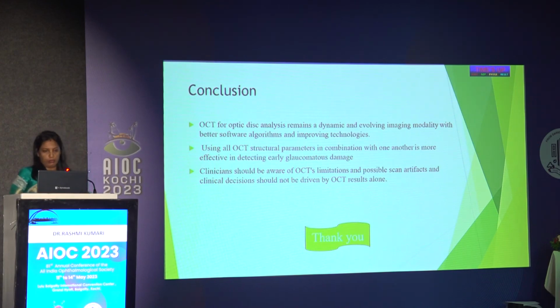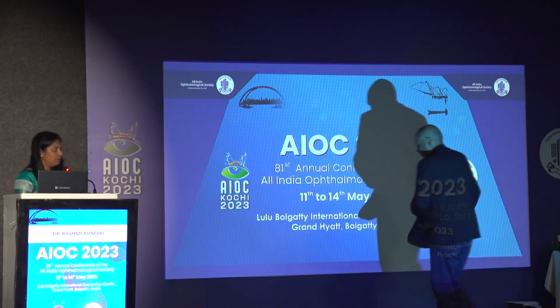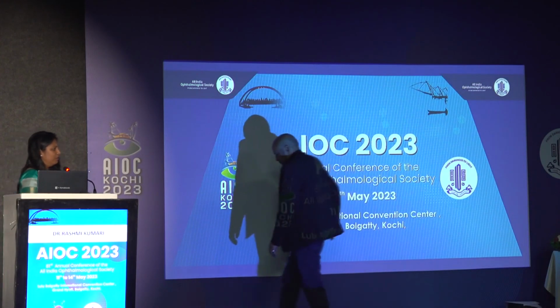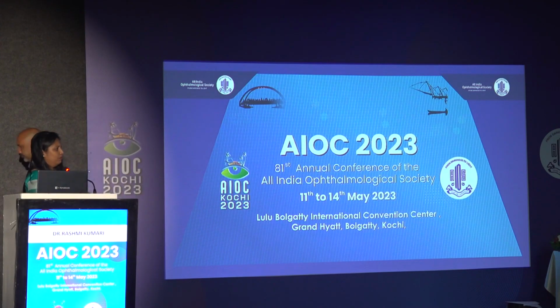Thank you, Dr. Rashmi. That was a very informative talk on the use of OCT in glaucoma. Just wanted to know, if there are some patients where it is not possible to do perimetry, then in those situations, would you advise that glaucoma treatment can be started just on the basis of OCT?